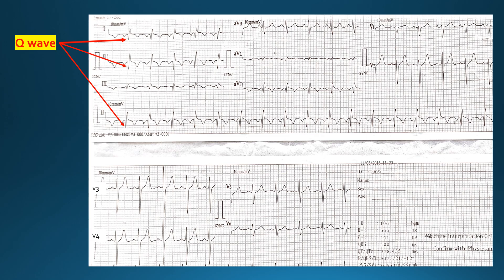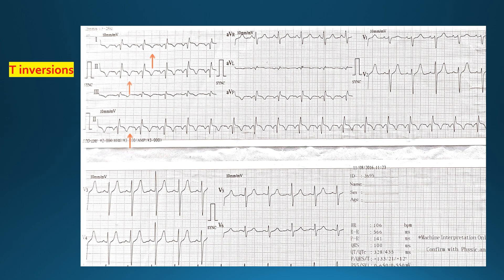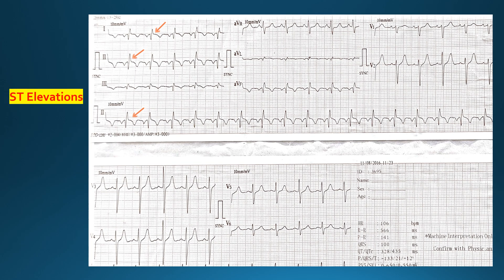Moving on, we can see that there are also T wave inversions. These T wave inversions are symmetrical, and again they are seen in the same leads showing Q waves. Now ST elevations are also present, but they are subtle. ST elevations should be picked up whenever they are present, even though they are subtle.